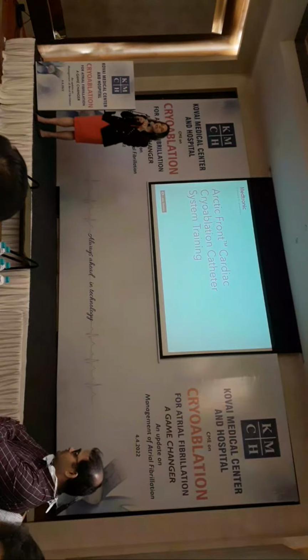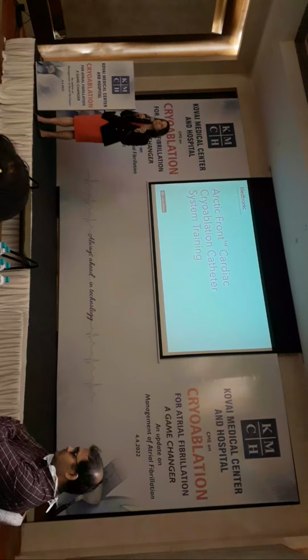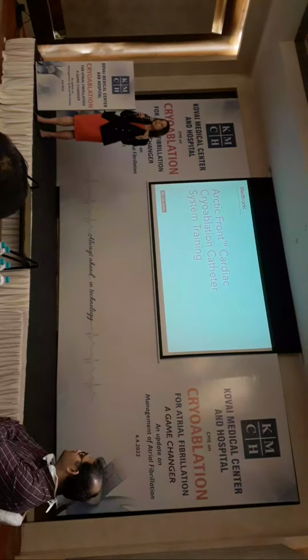And when we looked at the early AFib trials, which were mainly paroxysmal, but some persistent, and select out the paroxysmal only, the results look more like 85% of patients have significant reduction, instead of the actual data from the early studies with cryo balloon, which was 73 to 75%.